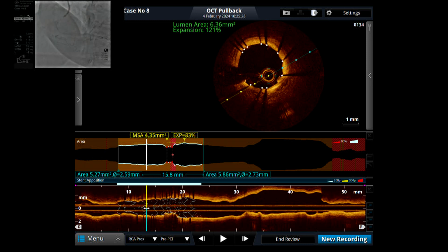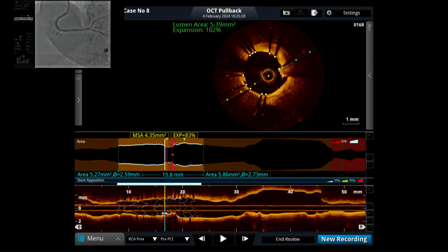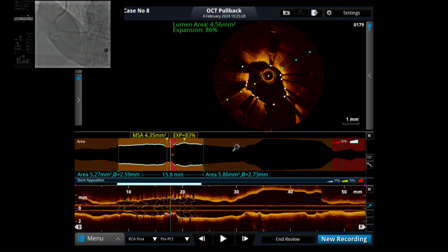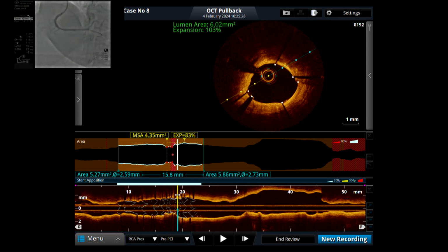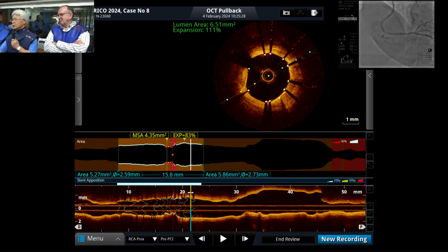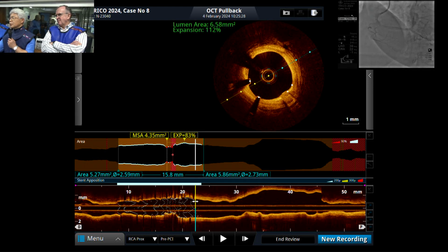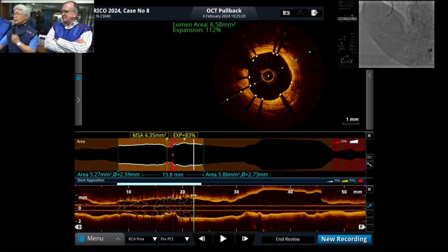The symmetricity is okay, right? And here is some protrusion. And here is a bifurcation. The proximal site is here. I think as a clinician, it is extremely acceptable to me. Proximal edge is okay. Perfect. Apposition is okay. And the landing area is also very healthy.